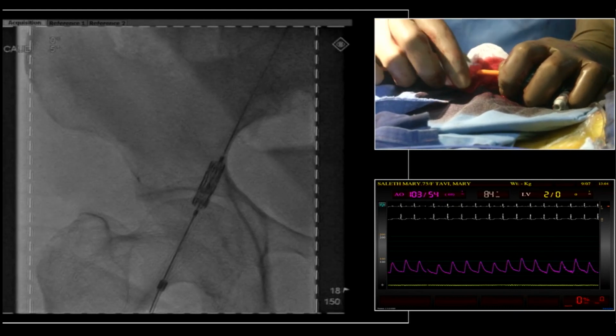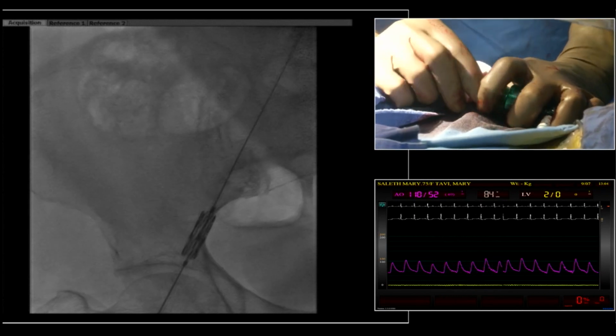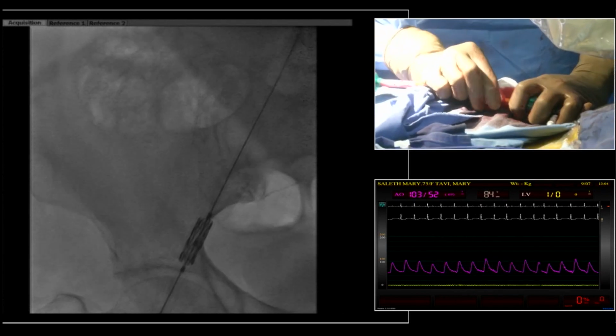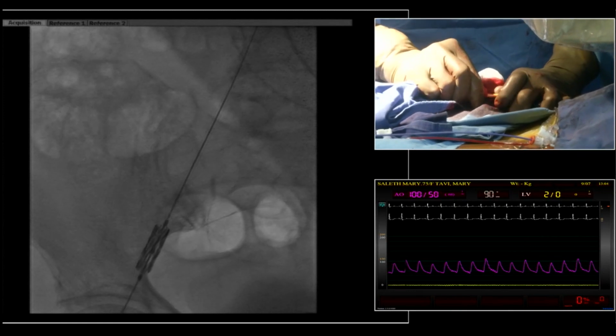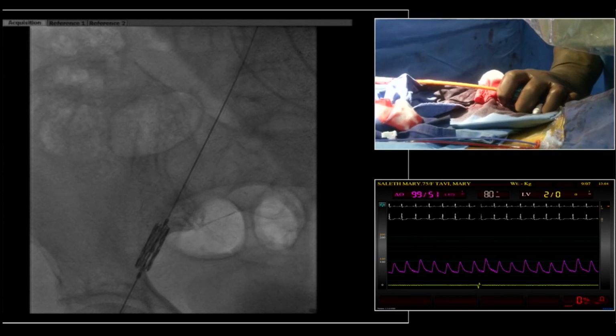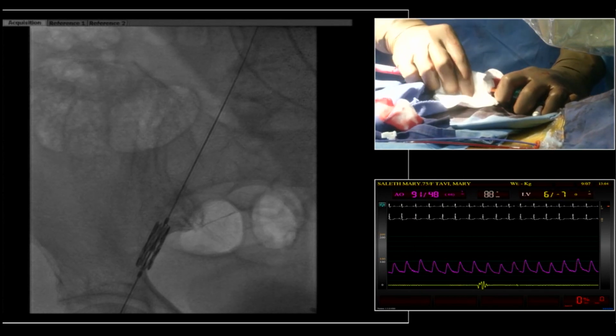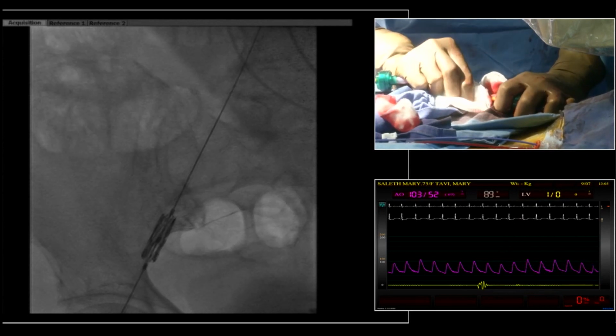There is some amount of resistance. So the resistance is at 2 points. Remember, it has to expand. It's only a 14 French sheath, but the vessel is not that size. Correct? So this is what you said earlier, and we said that's correct, because in that way, you must stretch both the sheath as well as the vessel.